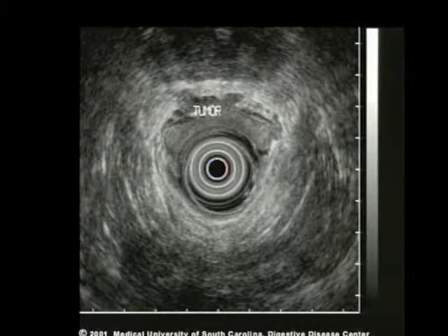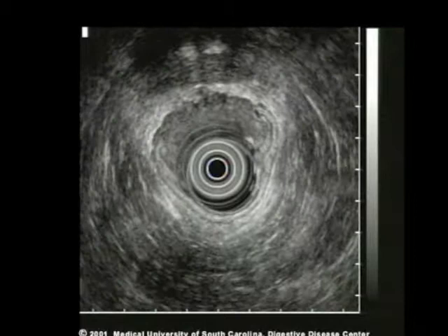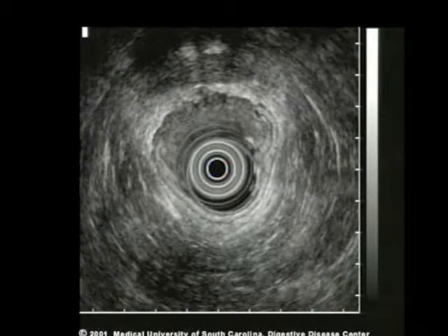As the transducer is slowly pulled downwards, the margin between the prostate and the tumor is lost for a short segment. This indicates a brief area of invasion into the prostate.